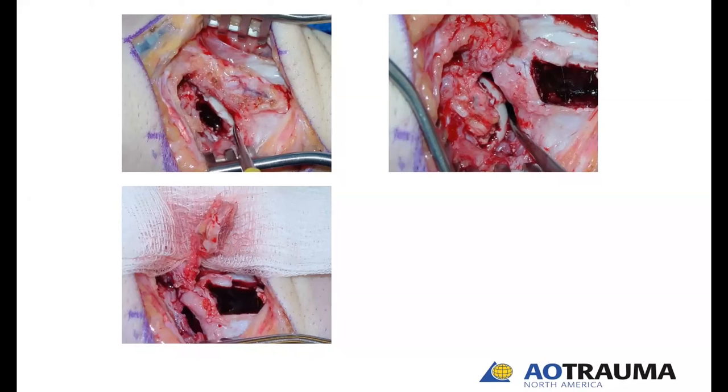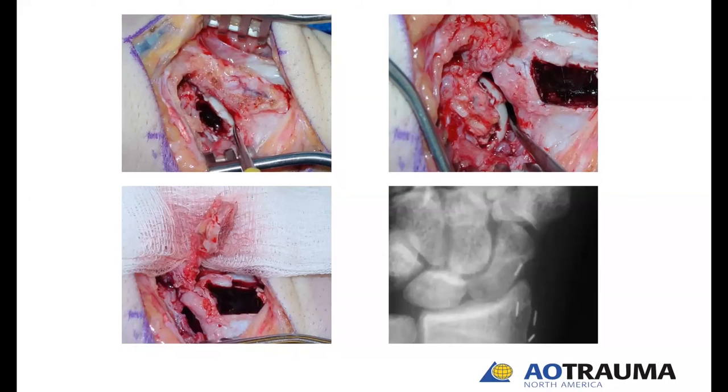That allows us to transfer the graft to within the scaphoid. It requires a fair amount of carpentry to take that quadrilateral bone and turn it into something that fits perfectly into the scaphoid. I use small rongeurs and nibble away piece by piece — it takes trial and error to get it to fit as perfectly as possible. This was augmented with K-wires. Here's that patient after removal of the K-wires — nine months after the operation.